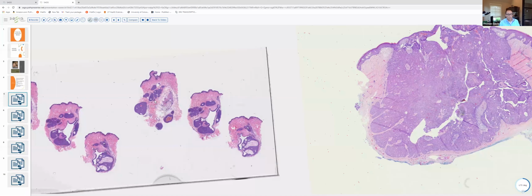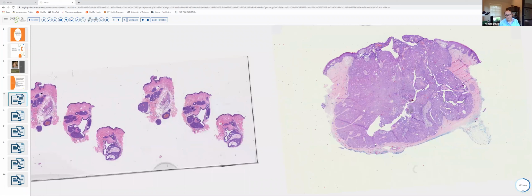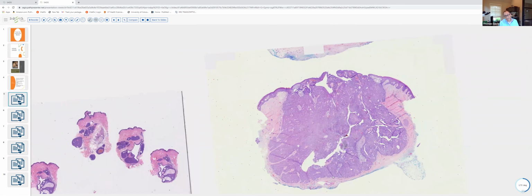First of all, before we do that, I think one difference we can appreciate right at scan is on the left, we have the dermal duct tumor. And you can see the architecture of this tumor is such that it's composed of multiple small dermal nodules without an epidermal connection, okay? If we look at our nodular hidradenoma, and hidradenomas in general, they typically are a single large dermal nodule or one or two dermal nodules, and they frequently will have an epidermal connection.